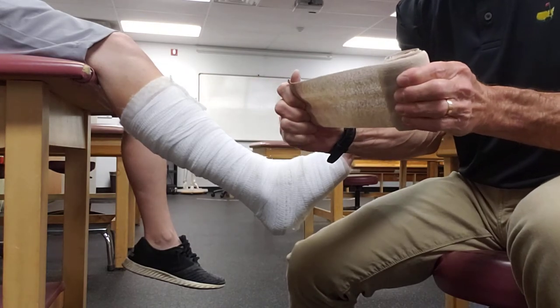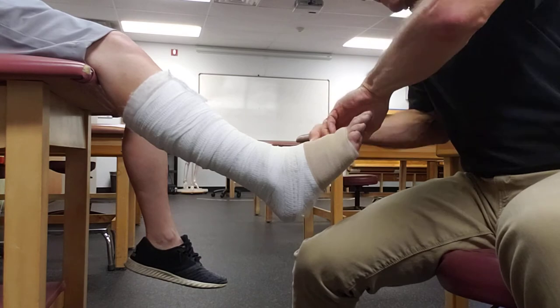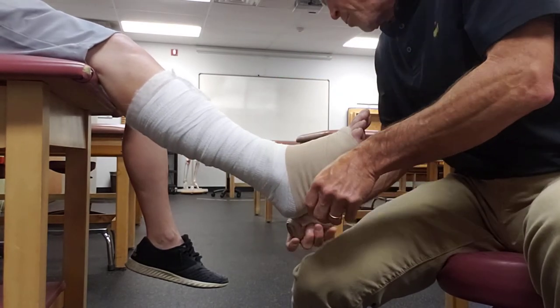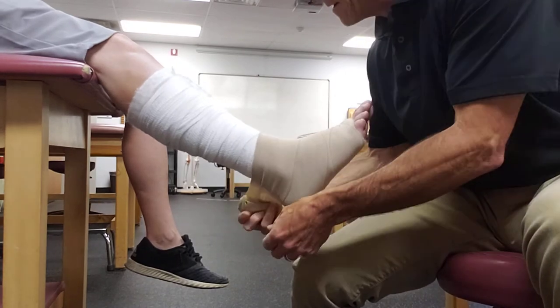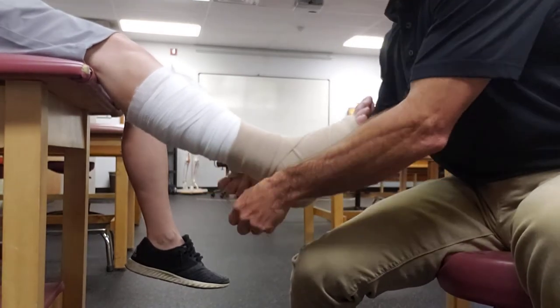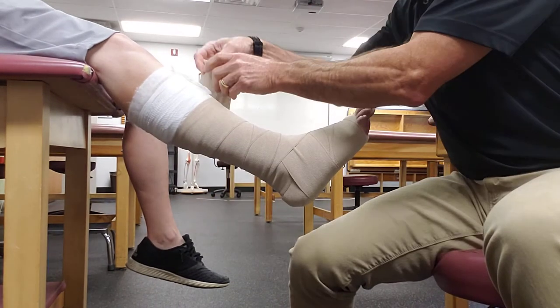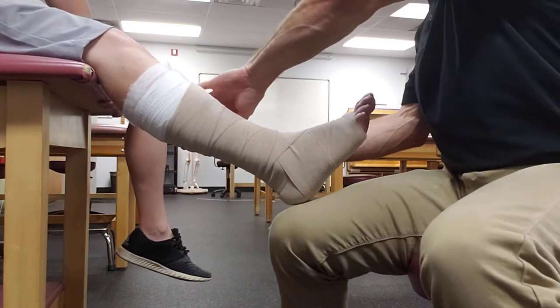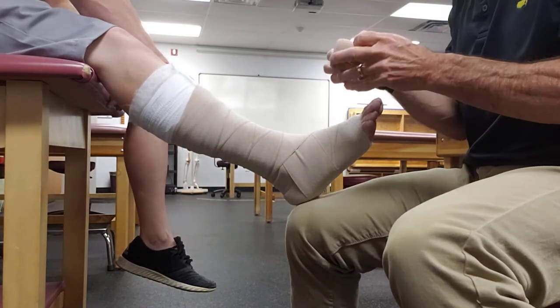Now the short stretch bandage is the layer that's really giving the person their compression. The technique is a figure-of-eight pattern, and you want to come pretty close down to the toes. You have to come up over the ankle appropriately and maintain the figure-of-eight pattern as you go, minimizing wrinkles as much as you can. You don't have to make it super tight — the bandage does enough compression. The idea with short stretch is to give a lot of working resistance as opposed to elastic resistance, so as the muscles contract while walking, it assists compression from the inside out.